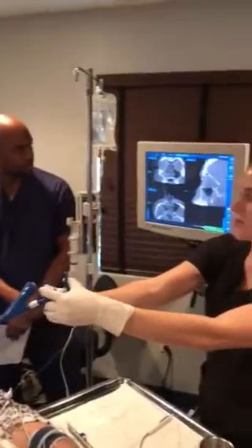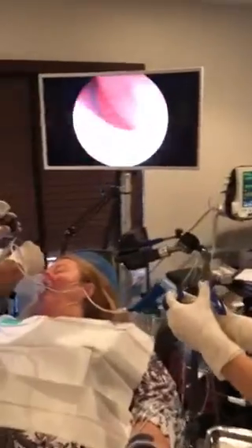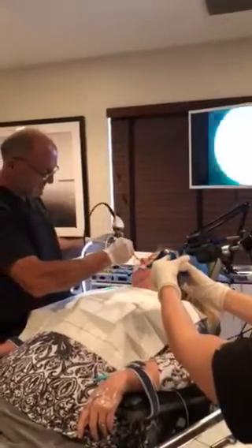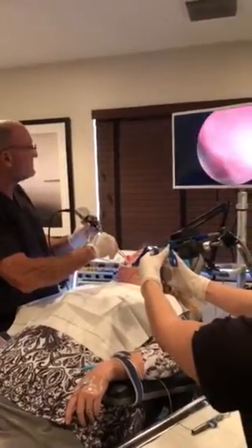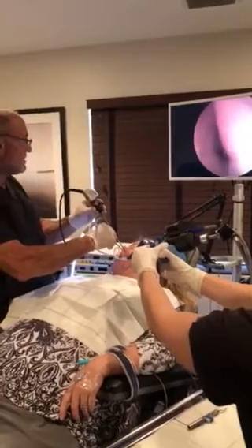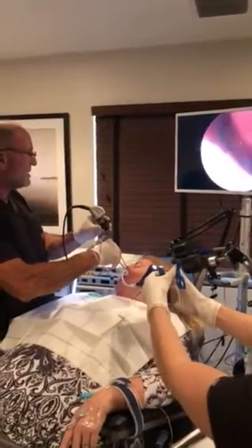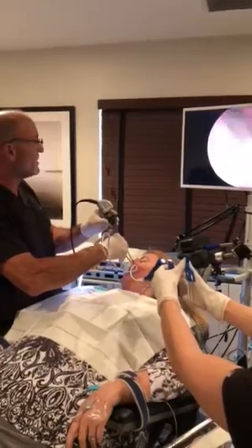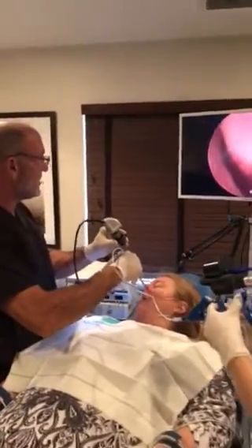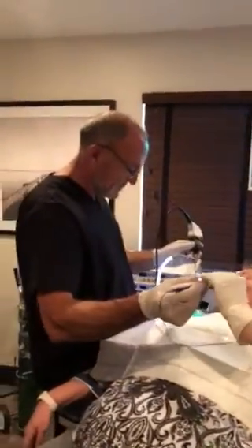Inflate. Deflate. Inflate. Deflate. We've made a very nice opening into that sinus so it will continue to drain.